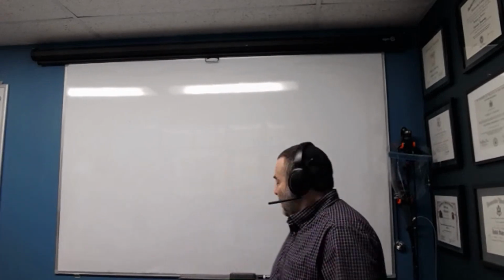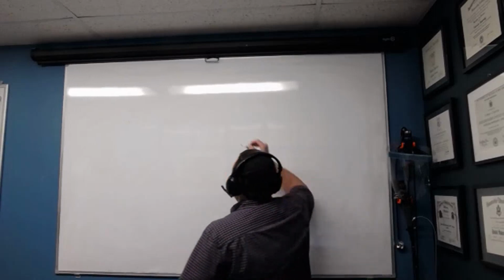So today's topic, ECG rhythm interpretation, the actual foundations of it.